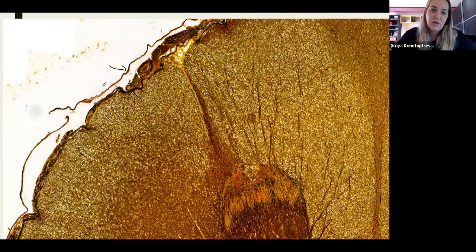If we talk about meninges, there is no dura mater. The dura mater was lost during preparation, so you can actually see the arachnoid and the pia mater. The subarachnoid space and subdural space are above it. This area right here is Lissauer's tract, so you can see how the axons are coming in this way. And this is the area of the dorsal horn where you can see the two laminas, lamina number 1 and lamina number 2.